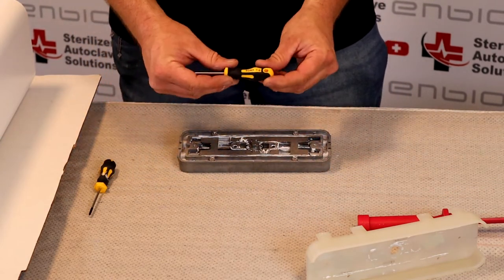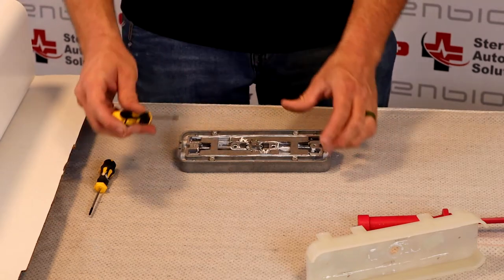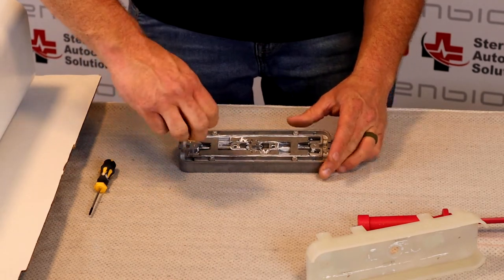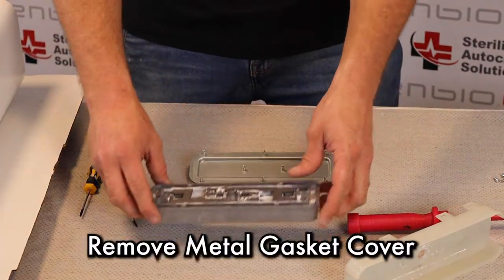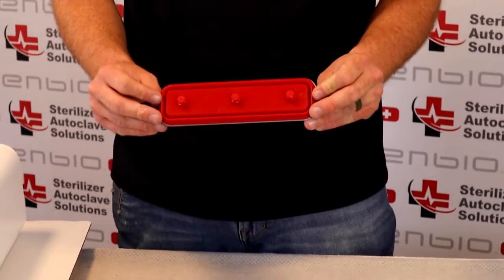To remove the four corners, it is a Torx T8. After those four screws are removed, I'm going to lift up on the metal base. And here is your door gasket.